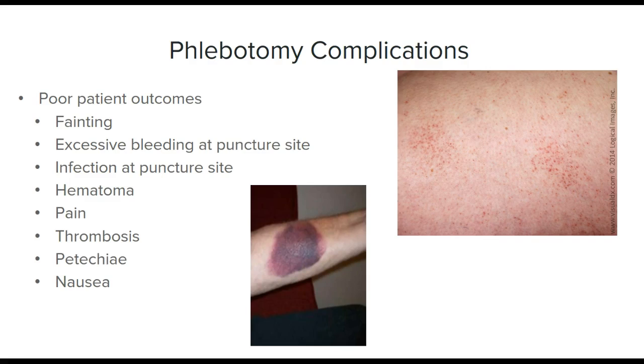This is one of the reasons why we have those phlebotomy chairs. If we have a patient who is in the bed, it's not a big deal. But for outpatients, we have those chairs, and the arm locks. And the reason that the arm locks is so if they were to faint, they wouldn't fall on the floor.